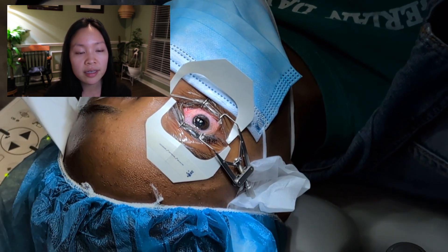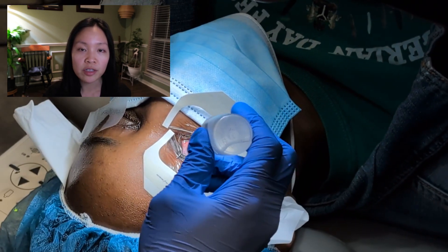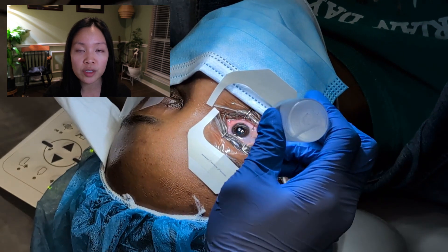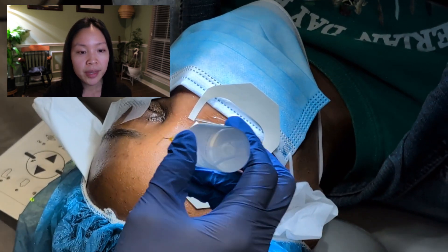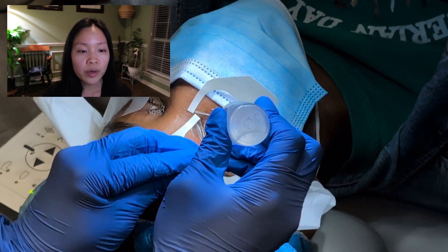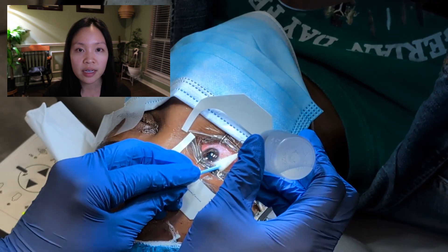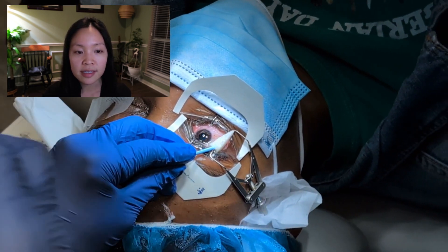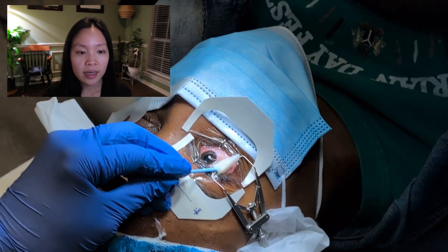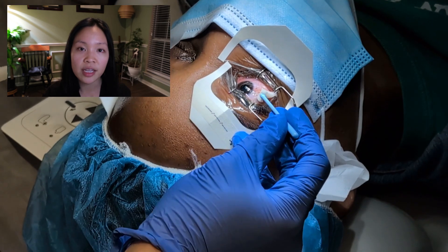This part involves a sponge soaked in a medication that helps prevent haze from the cornea, which is a complication that can be seen sometimes after PRK. We then irrigate the medicine off the surface of the eye with a lot of balanced salt solution — BSS saline — just to flush and irrigate the eye, making sure no medication is left over.